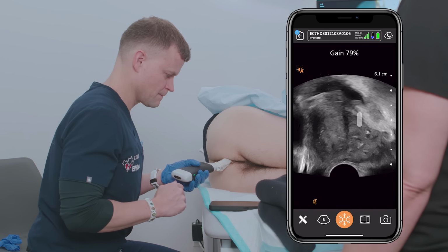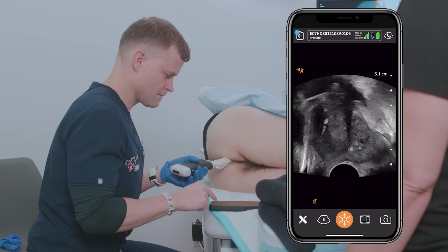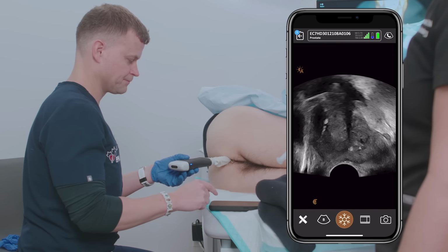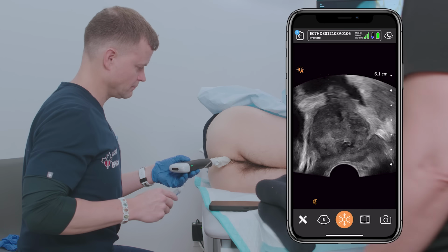In this case, you can notice that I'm only looking at the screen of the phone for the entire procedure. I'm not gazing away, looking at a standalone ultrasound machine, and therefore the economy of motion and efficiency is optimized.